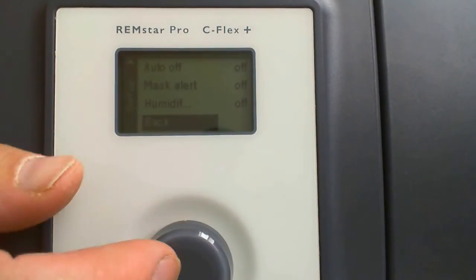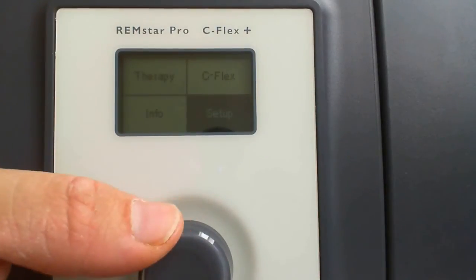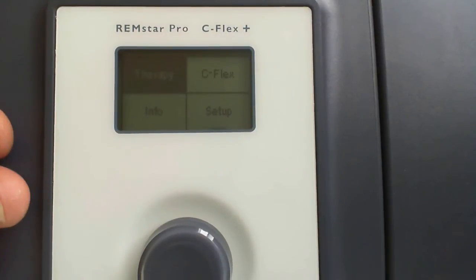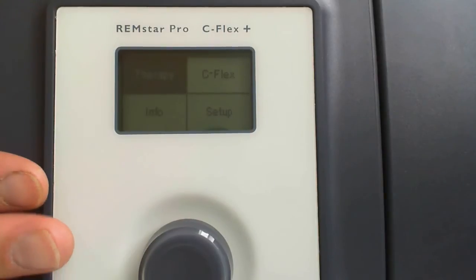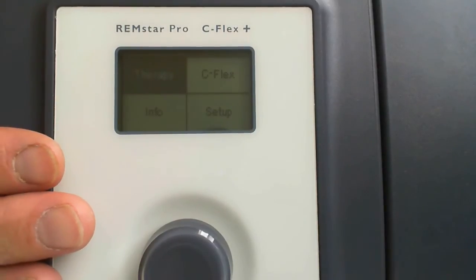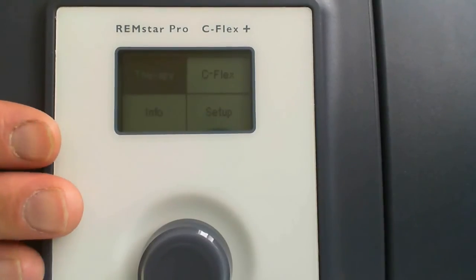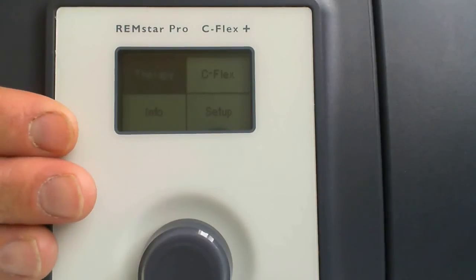So now we're at the bottom. We can get the back button again, and now we're going to come back to our main setup menu. So that is the patient section of this menu. Now, I said it before, I'm going to say it again. I'm not about self-treatment. So I'm not going to show you how to get into the Clinicians Menu. I mean, if you're computer literate enough to find this place, you're able to find out how to do it. And that's all I'm going to say about that.